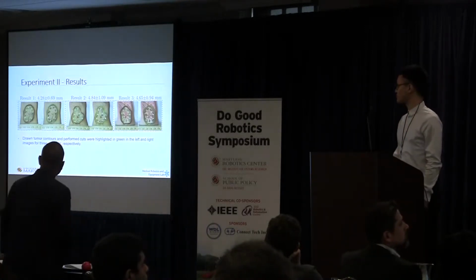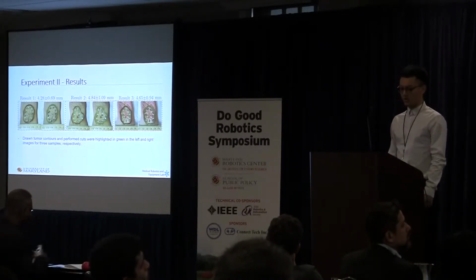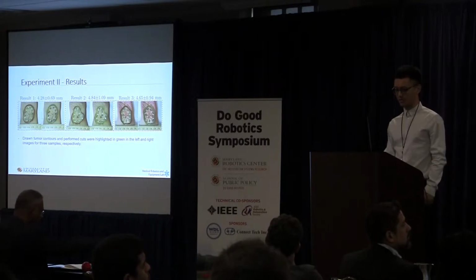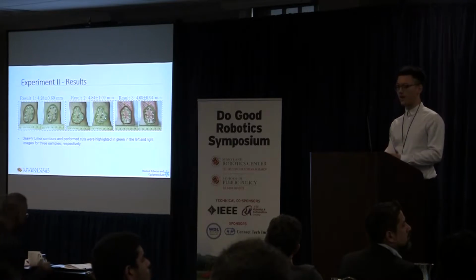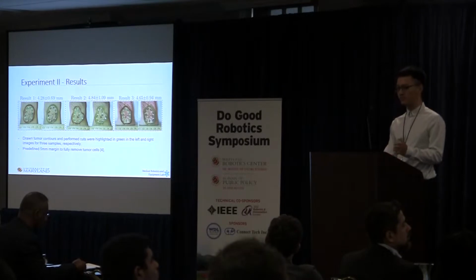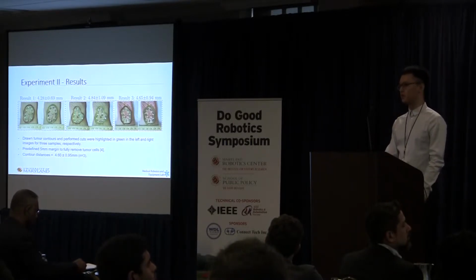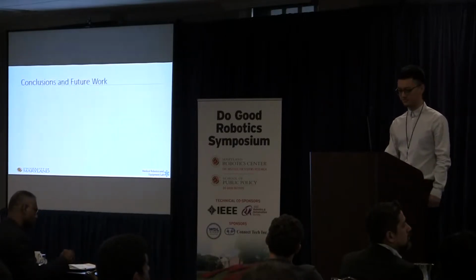Those three experiment results are shown in this slide. In the left images, we highlighted the ground truth of the deformed tumor shape. On the right images, we highlighted the actual cutting path. By comparing them, their difference should be the predefined 5 mm, and it's pretty close. So we proved that we successfully achieved sub-millimeter accuracy in this supervised autonomous tumor resection.